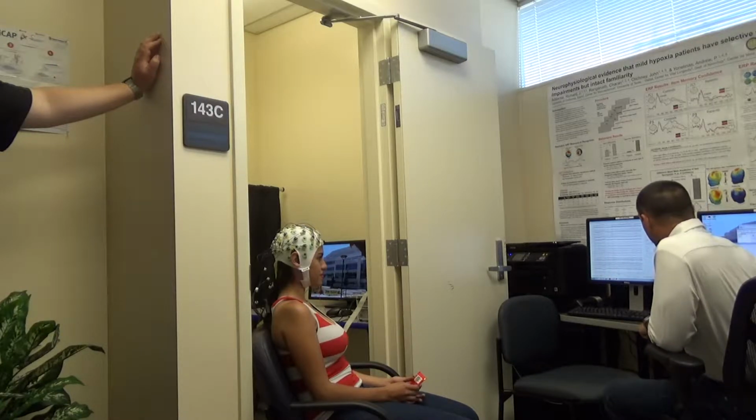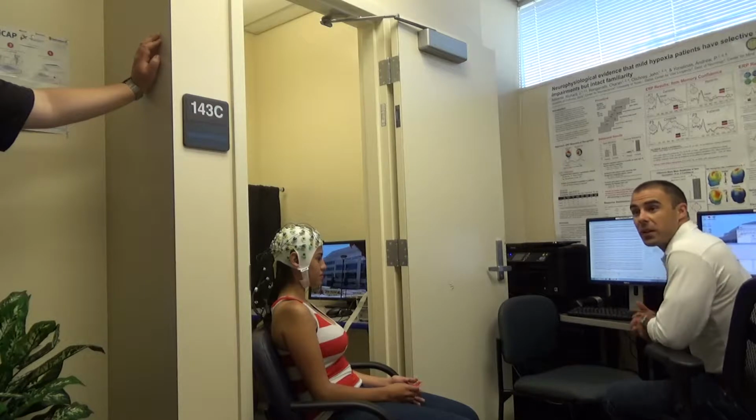So, we will see this sort of working in this regard, and what we can see is that there's a handful of electrodes that are connected here, and we can start to see that there's going to be some changes that can happen based on how our participant behaves and what they do.